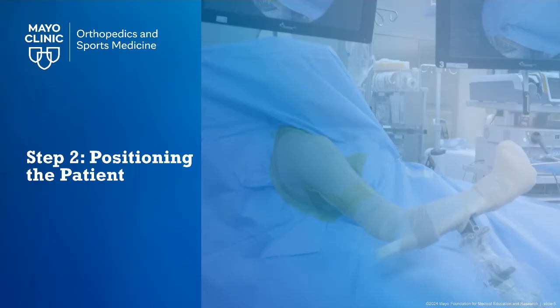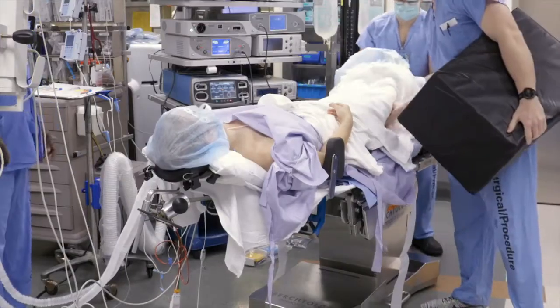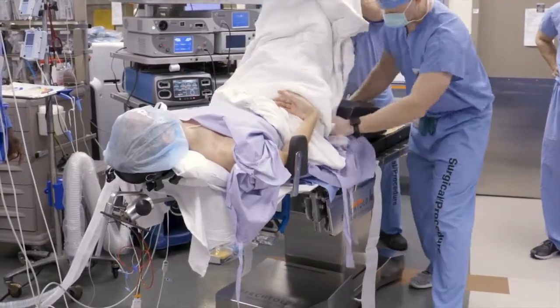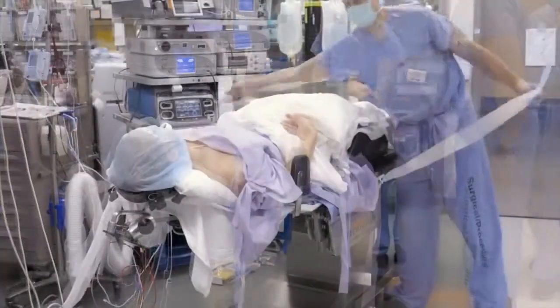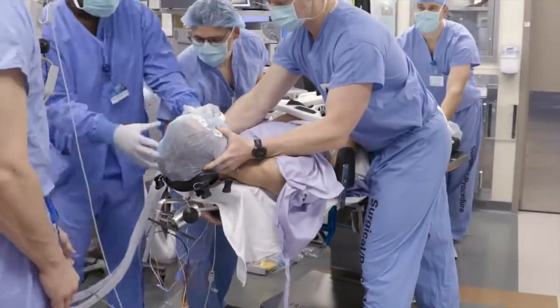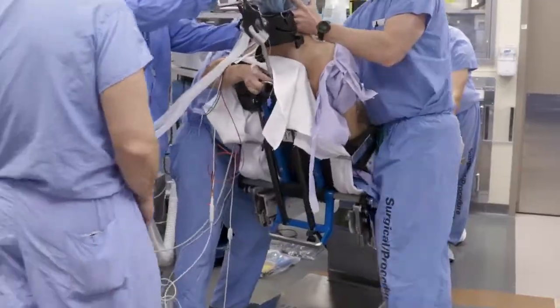Now we are ready to position the patient. The patient is asleep and the lower leg wedge is placed under the patient and pushed up towards the buttock. A thigh strap is then applied and while one person is holding the head securely, the pillow is removed and the table is raised up, allowing the patient to be sitting upright in the beach chair position.